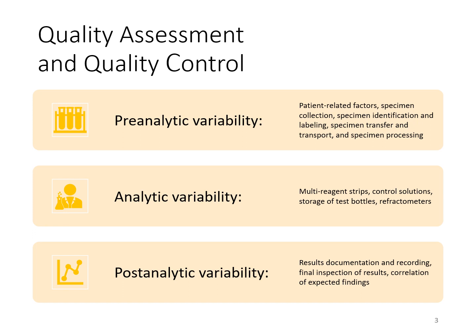For the analytical aspect, we look at the use of the reagent strips, control solutions, and how the strips and QC are maintained and stored, and making sure that the use of refractometers is QC'd, although most labs do not use a refractometer anymore. Making sure that QC is performed daily, and that all your reagent strips are QC'd when they're put into use. Those are your analytical variables.